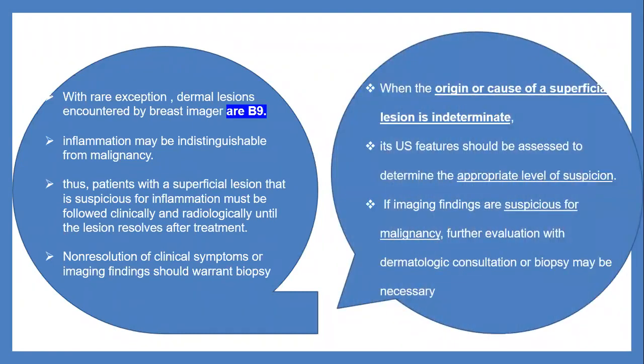When the origin or cause of a superficial lesion is indeterminate, we have to evaluate it by ultrasound to assess the appropriate level of suspicion, and if any suspicious features for malignancy are encountered, further evaluation with tissue diagnosis should be considered.